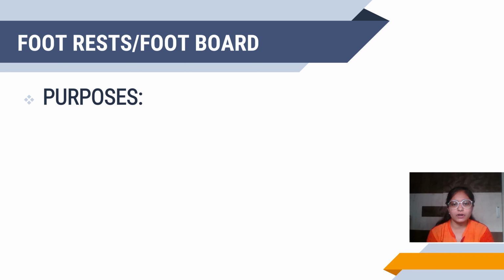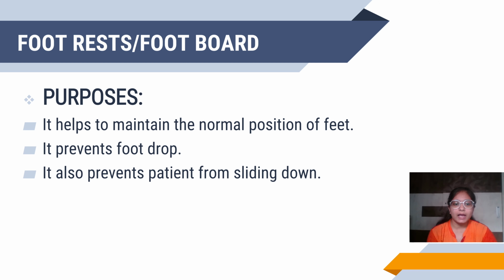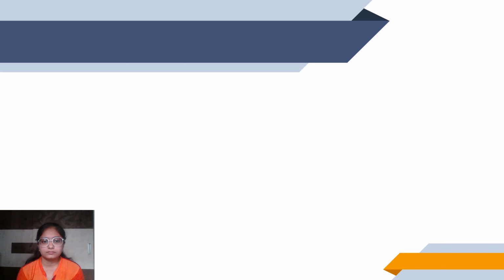Now, purposes of footboard. It helps to maintain the normal position of the feet. It prevents foot drop and also prevents the patient from sliding down. An important comfort device which is mainly used in hospital is bed blocks.